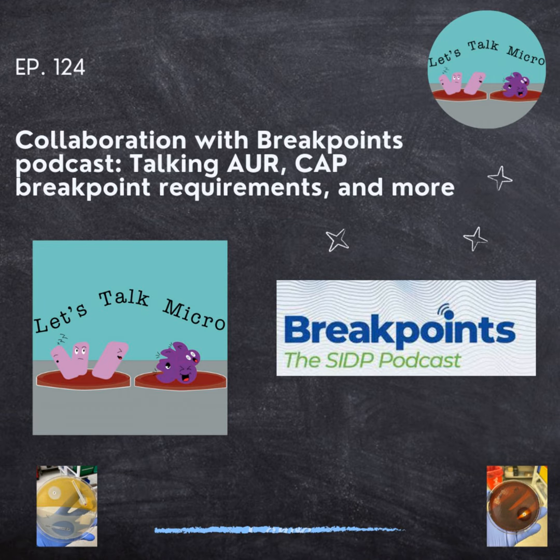The laboratory has to do some internal work. The best way to start is probably after February or the beginning of every year, because that's when CLSI releases the new breakpoints. In the previous year, CLSI normally releases some communication about the changes that are coming. If your laboratory uses CLSI, that would probably be the best way to get the new breakpoints and compare against what you report, organism by organism, and based on the different methods that the facility performs: if it's an automated MIC platform, or a gradient method, or a disk.